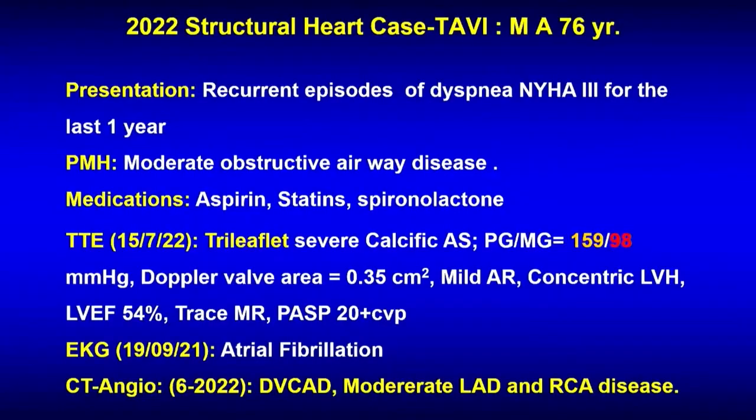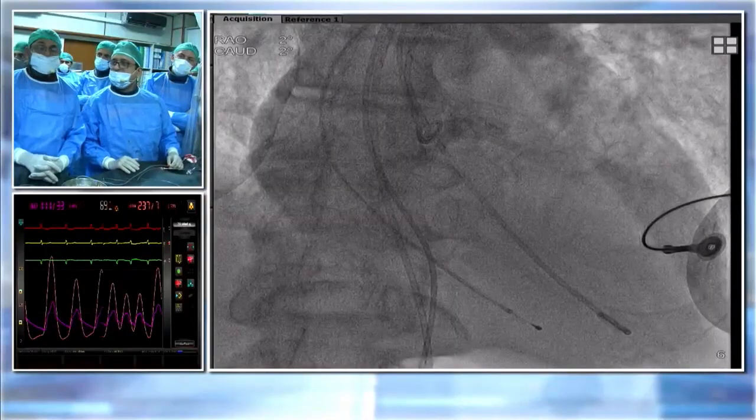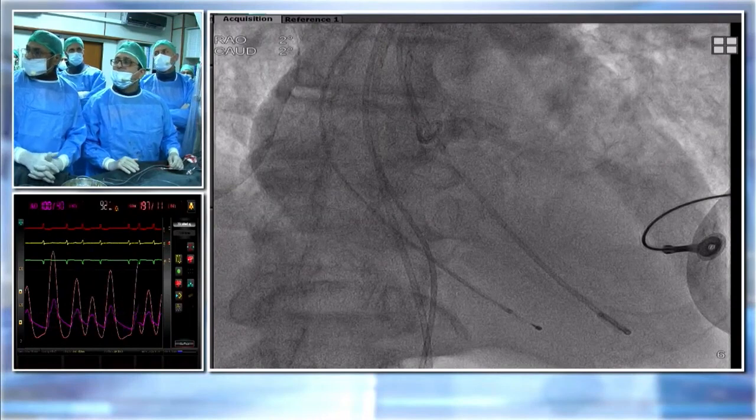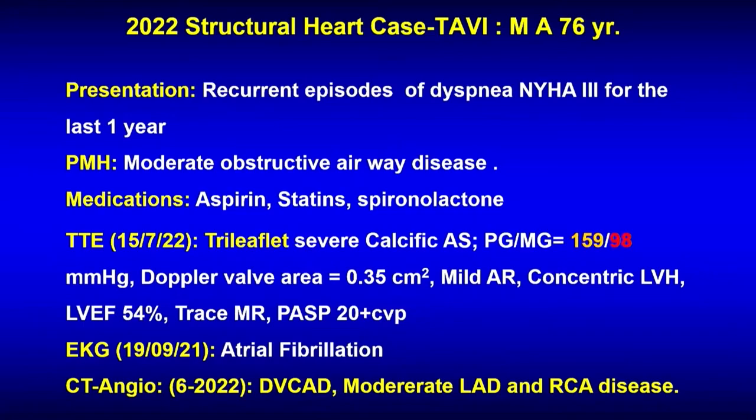We can see the gradient, it's quite impressive. Yeah, it is. This was a slide for the slide basically. So this is our, yes, we can hear you. No, the slide just went away. Here, we can see it now.